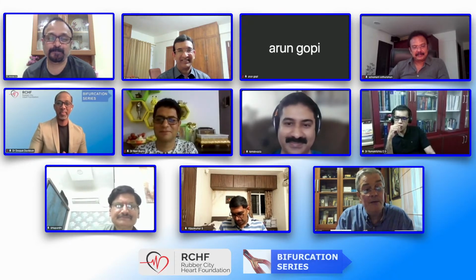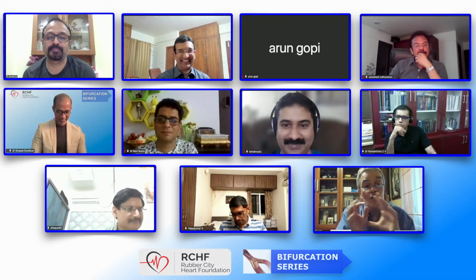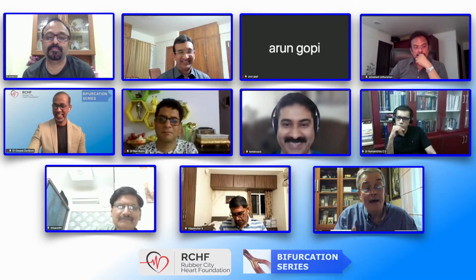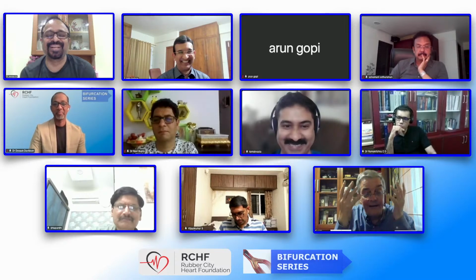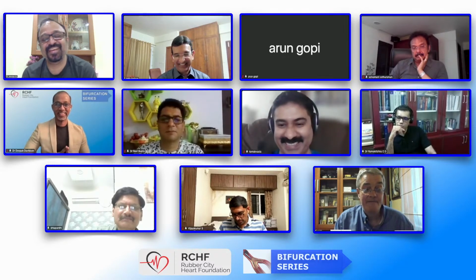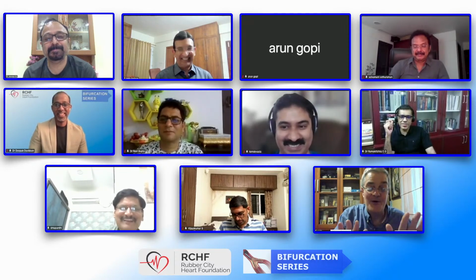They are so good in performing DK crush, but I'm not so sure they're so good in performing provisional. And in Europe it is exactly the opposite. For us, we dream about T-tap culotte, and when we think of DK crush, we think of some smashed metal inside the coronary artery that philosophically for us is difficult to accept. With full respect for all of you who know how to do it.